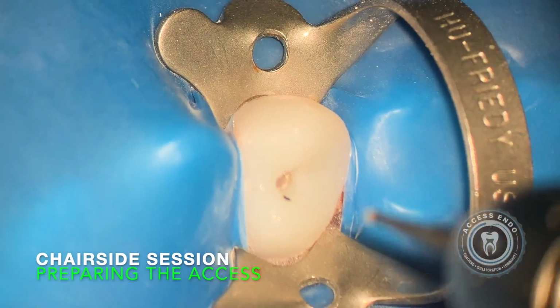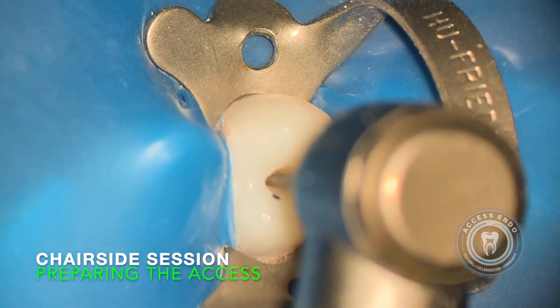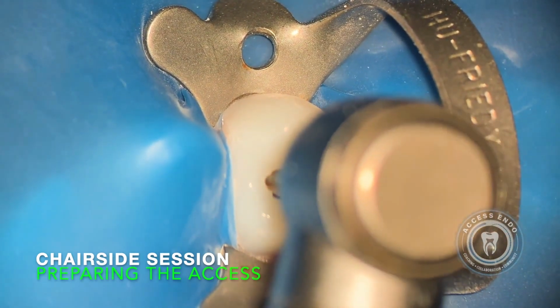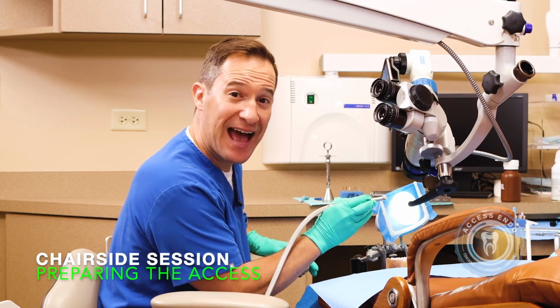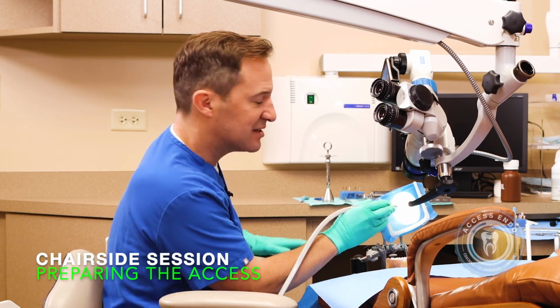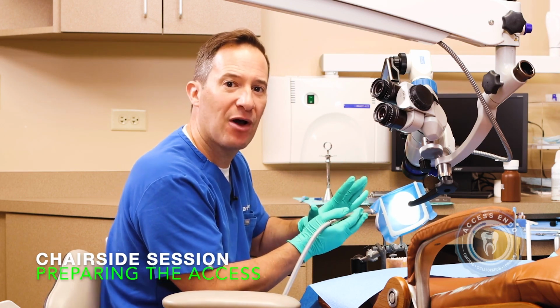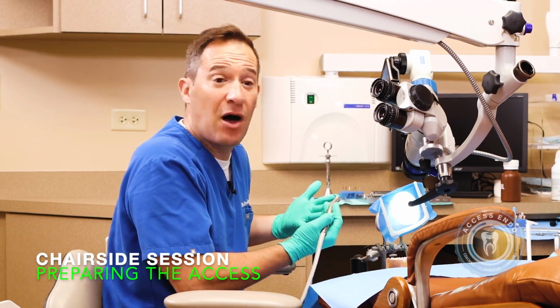So you want to come back, and without even putting your foot on the rheostat, I like to put the burr back into the tooth and just look at the angulation of it. Just check: am I headed the right way? When you don't have your foot on the gas, it makes it really easy to recheck yourself. This is a process you want to take your time with, because this is critical. If you perforate this tooth, it's likely going to be lost in many cases.